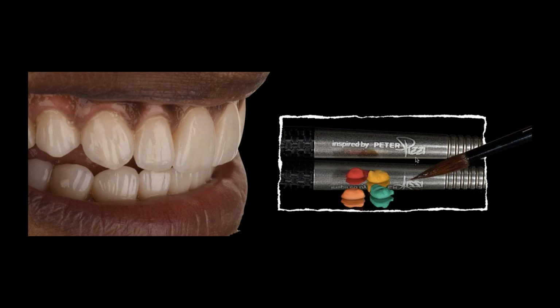Because you have to understand that the further out I go from the internal, the more translucency I have, the lower your value is going to start to come. So I'm going to always push the internal brightness and then just get more and more translucent towards the outside.